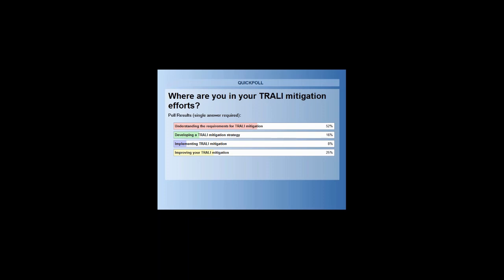Thank you. Another question that's been asked is, can you tell us a little bit more about how you develop your cutoffs? Yes. For HLA class 1, we set the negative cutoff to 1.5. The positive cutoff is set to 4. That means we have a gray zone. And all samples with a ratio in this gray area, we test by PIA 1 and PIA 2.